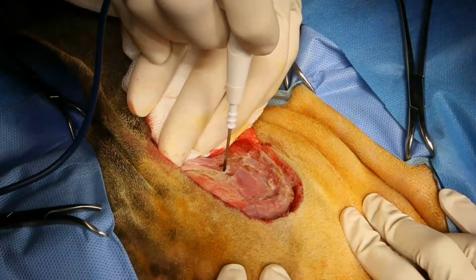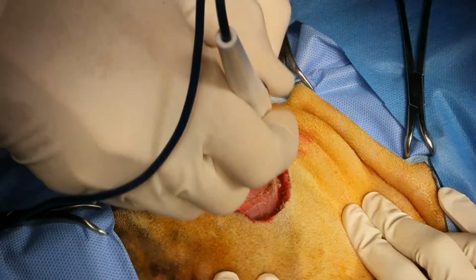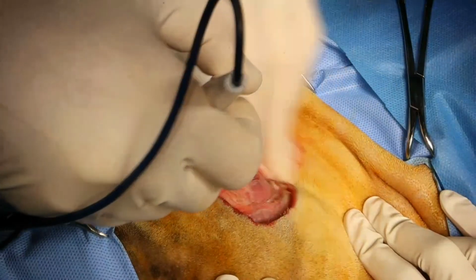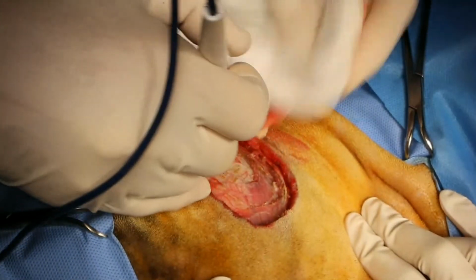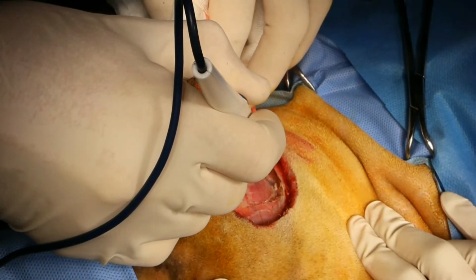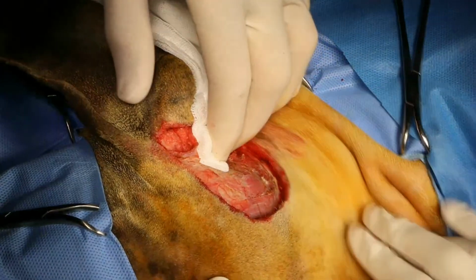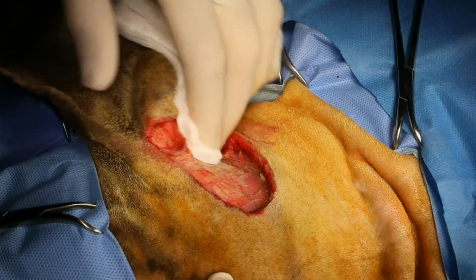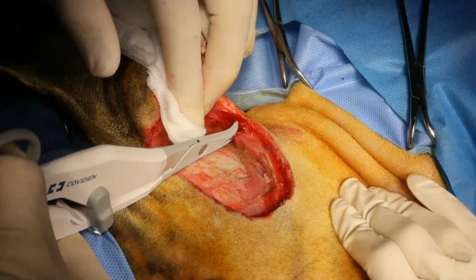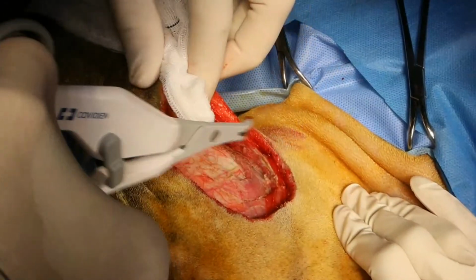I'm trying to keep a wide margin, particularly deep. Now, if we do get necrosis of the pinna, we may have to come back and amputate that in the future.